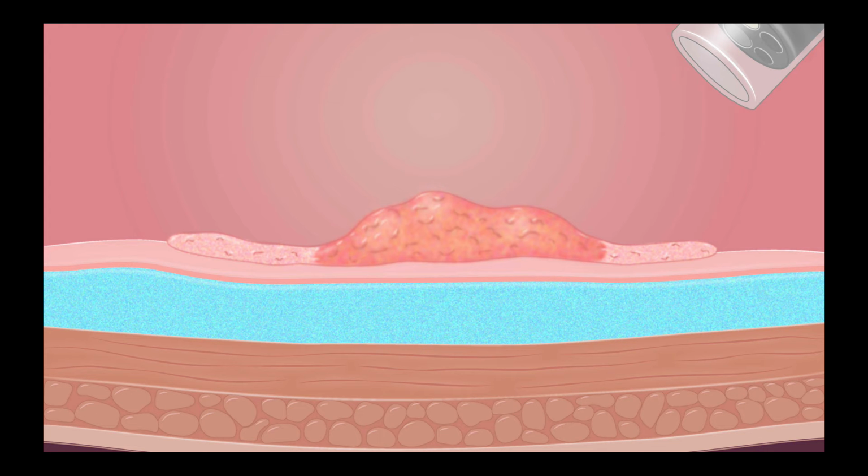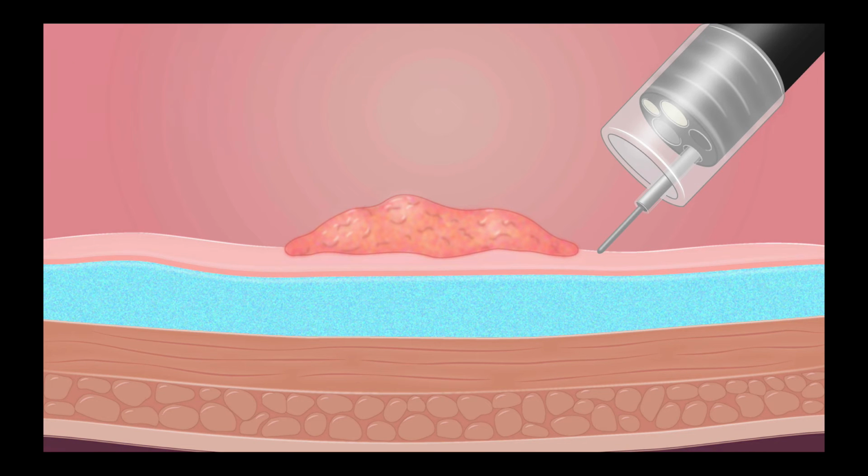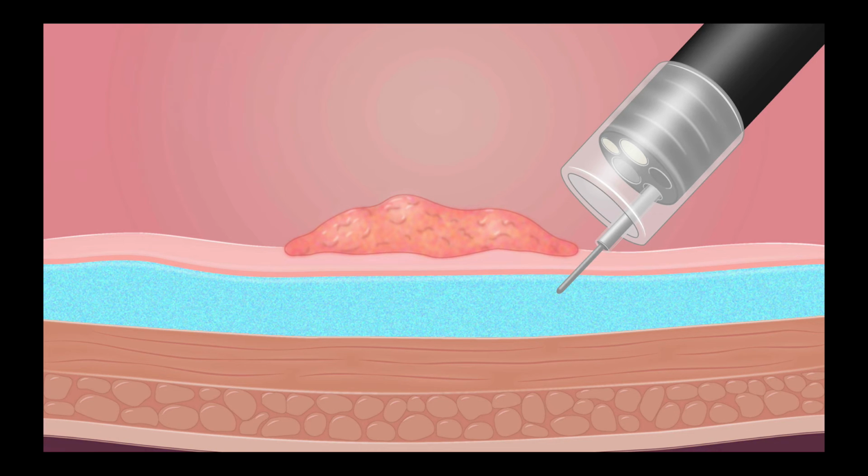Let's talk about how to do successful submucosal injection. When you see a lesion, you get your catheter out and then ask your assistant to push the needle out as you give yourself space to have the needle come out in the lumen without penetrating the wall, and with a gentle push of just a couple of millimeters, you enter the submucosa.